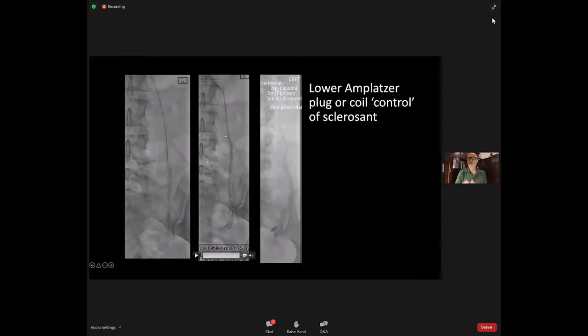I think the Lipiodol causes a little bit of venous spasm. You can see it sits in that perivenous vascular plexus, but it doesn't flood it. So I don't get a massive phlebitis in the pelvis. So I find that useful as a kind of coil assisted.